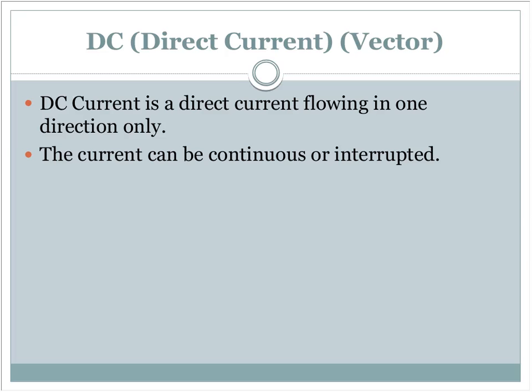In this particular situation, you can attract positively charged ions like hydrogen ions, and H plus creates acid. Or you can attract negative ions under the positive electrode, and OH minus ions are what make up alkalis. And alkalis can sometimes be actually more irritating to the body than acids.